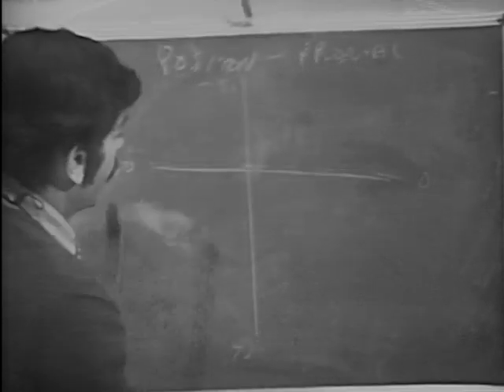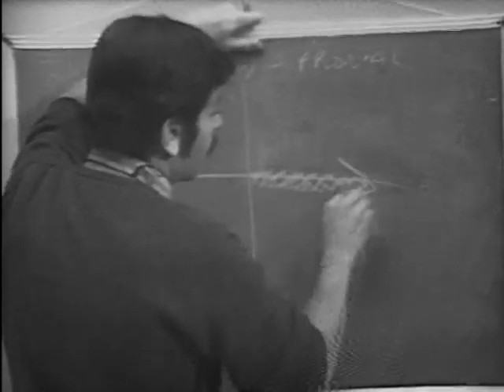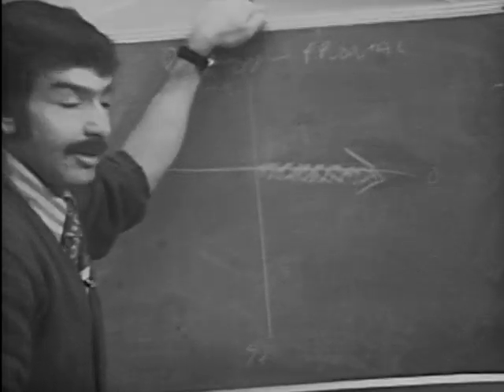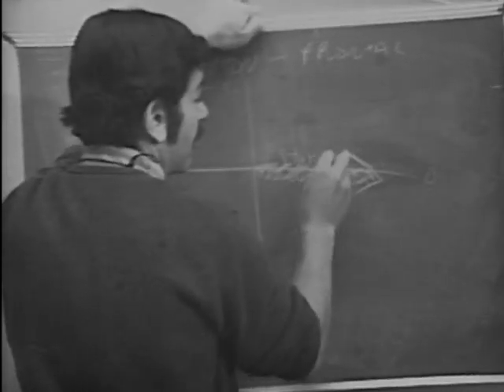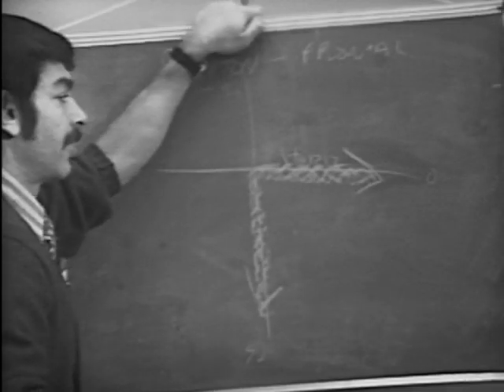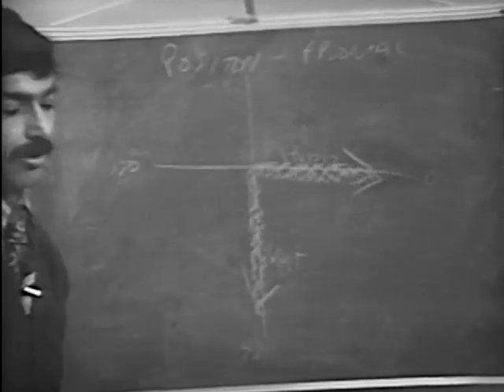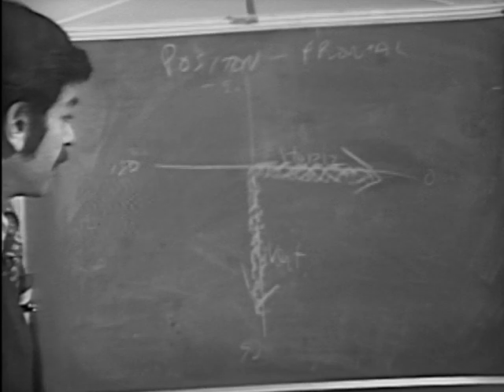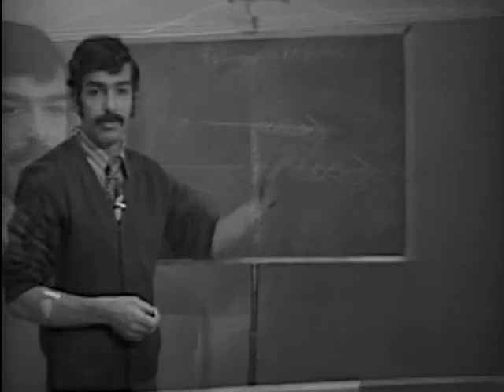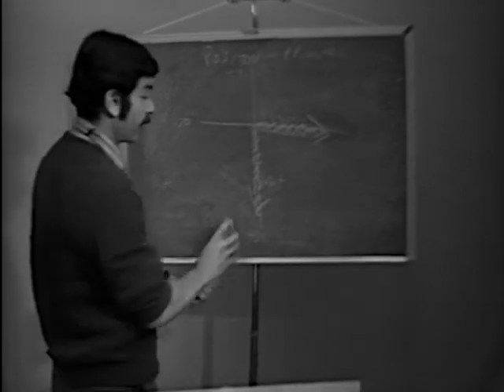So, as we said just a few minutes ago, if we have an axis going out this way, we call that position. The position of that heart would be horizontal. So this would be horizontal. If we have an axis going this way, we'd call the position of that heart, or the axis of that heart, to be vertical. Okay, that's pretty obvious and simple. But it's important, particularly in terms of implications about normal and abnormal T waves. The position of the heart has to be considered.